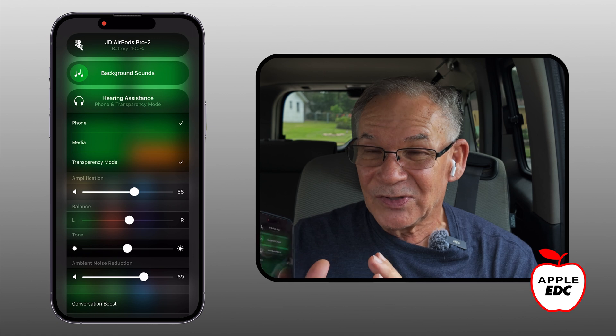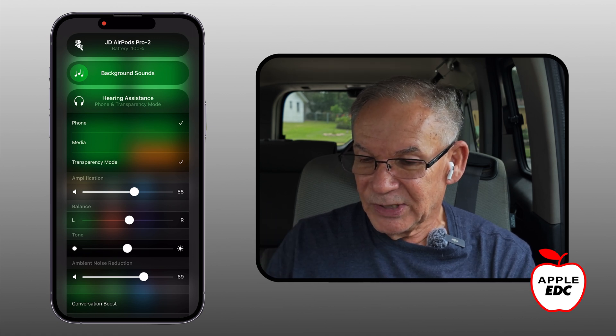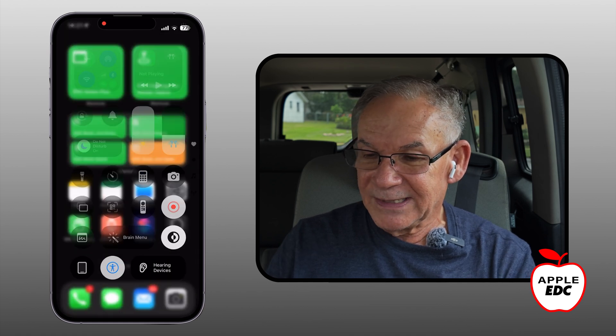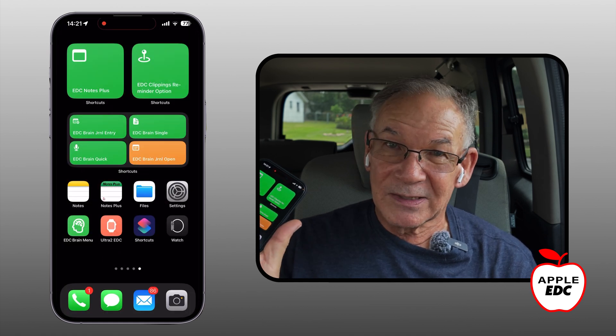I find this to be very, very handy. If I just tap away, I get back to the control center, and then tapping away again gets me back to my home screen.